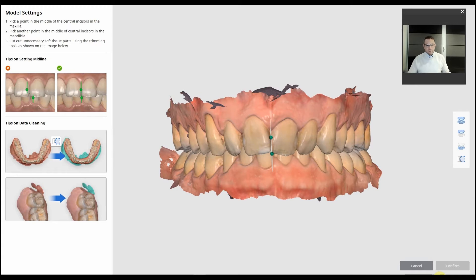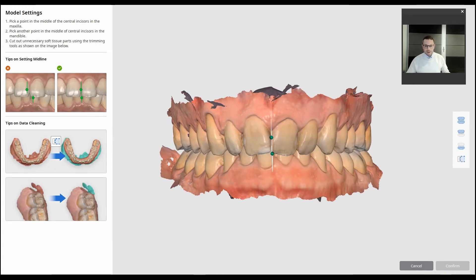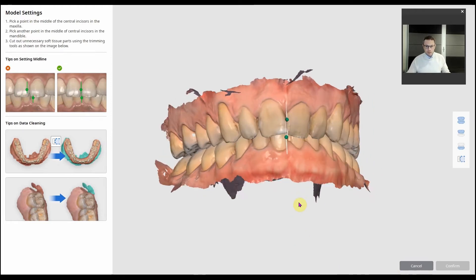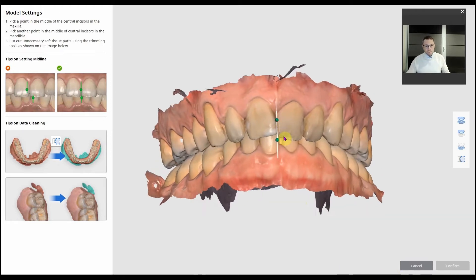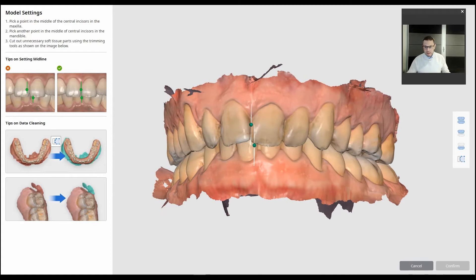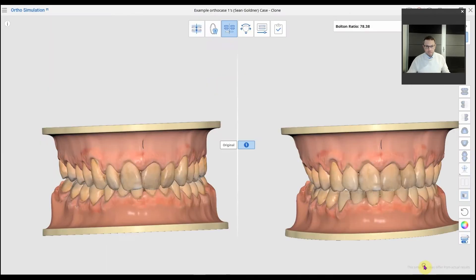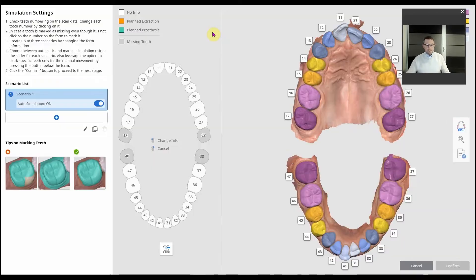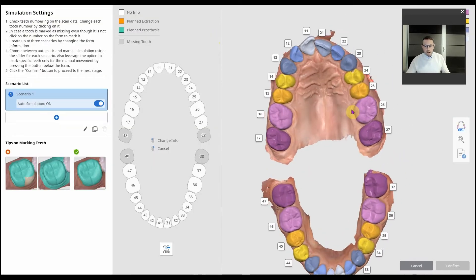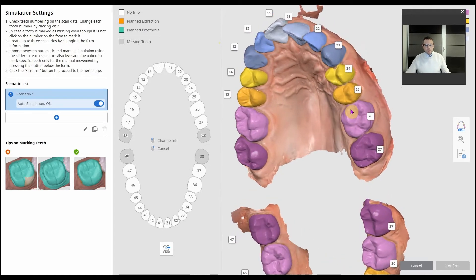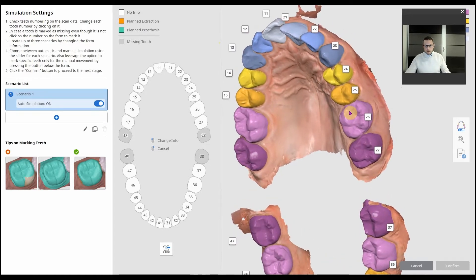This is my favorite app and probably the most useful app for patient engagement. After doing a scan of upper and lower, you go into the author simulation and just set the midline — it's really simple. Then what the software does is absolutely amazing.